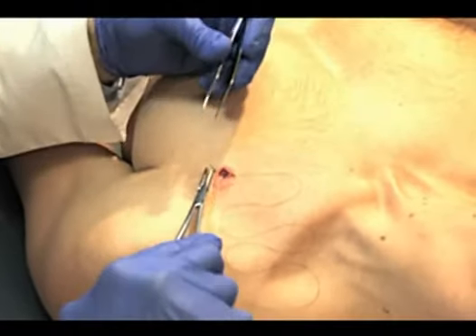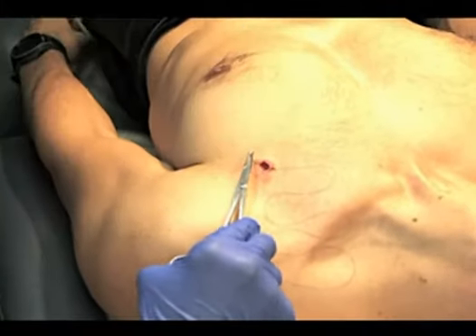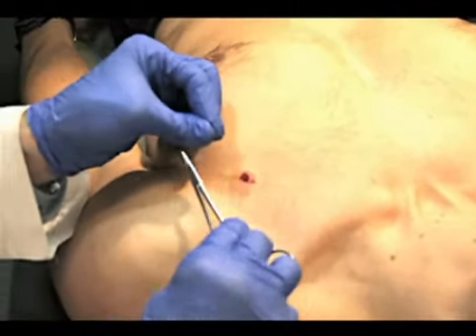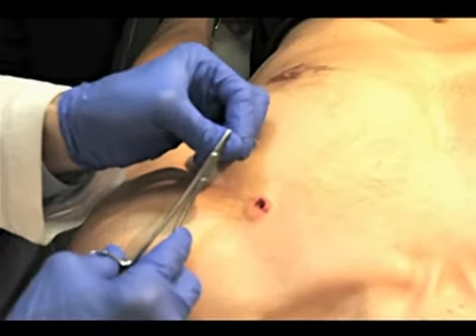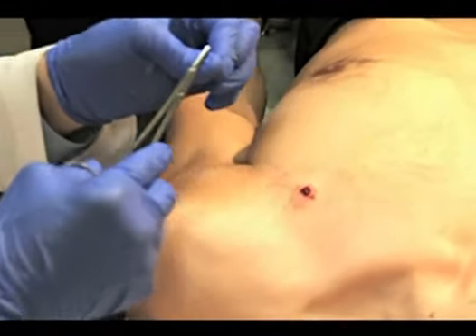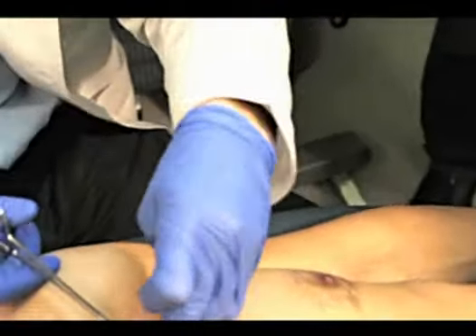When it emerges from the skin, grab the point with your palm down, handing the blunt end of the needle to your index finger and thumb. Circle the suture around the needle driver twice, then rest the driver on your thumbnail to prevent the suture from slipping. Pull up on the thread until the free end of the suture is short and secure it with the needle driver. Next, spool the suture.